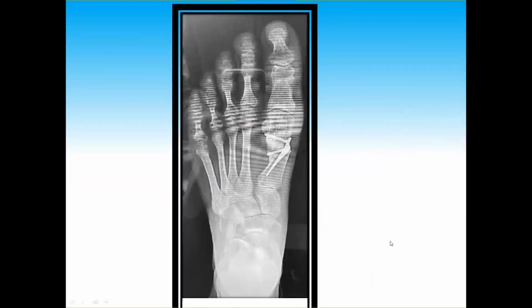You see here the amount of consolidation that's occurred at 2.5 months. I know the x-ray is not the greatest quality, but you can see how much bone formed into that lateral area where I mentioned that we stretch the periosteum, but we don't really injure the periosteum laterally.